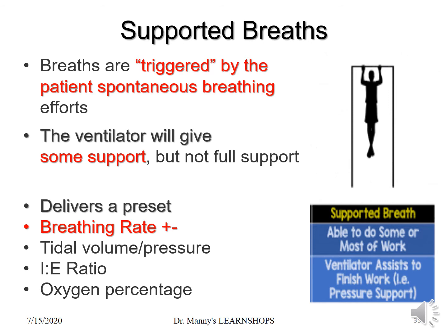So if you see the term control, the machine is in control. If you see the term assist, the machine is still in control but assisting a little bit. If you see the word support, the patient's doing most of the work. Machine only helps a little bit.